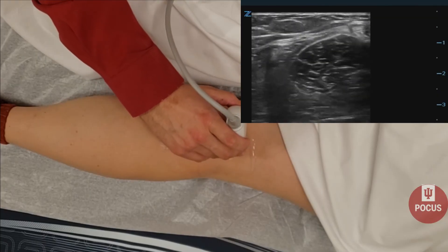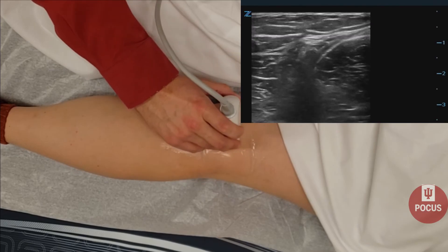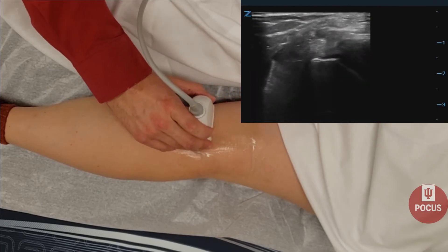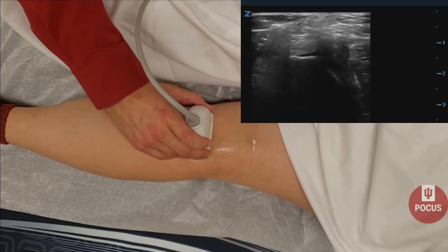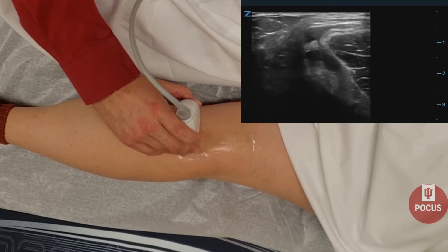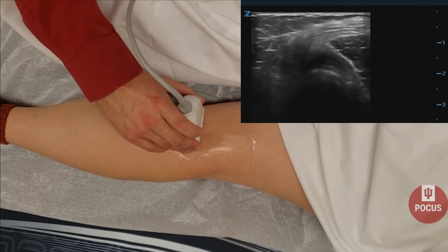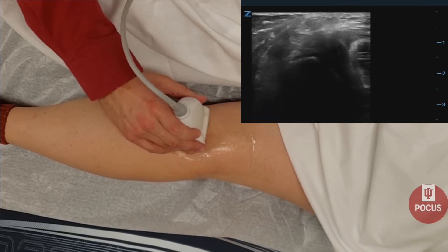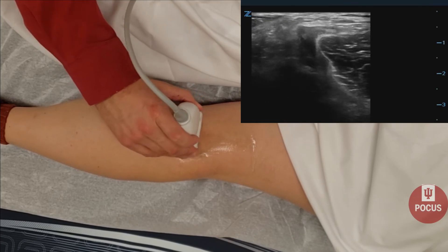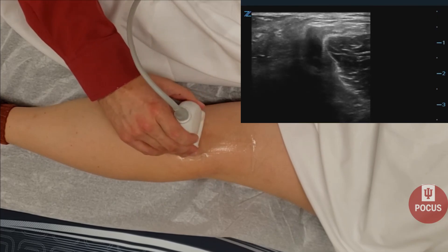Next, we'll look for a Baker cyst. This will be between the medial gastrocnemius tendon and the medial hamstring or the semimembranosus. We'll look right where the tendons are for the stalk. This patient happens to have a very small one. You can look at that Baker cyst in long axis and in short axis to take measurements.